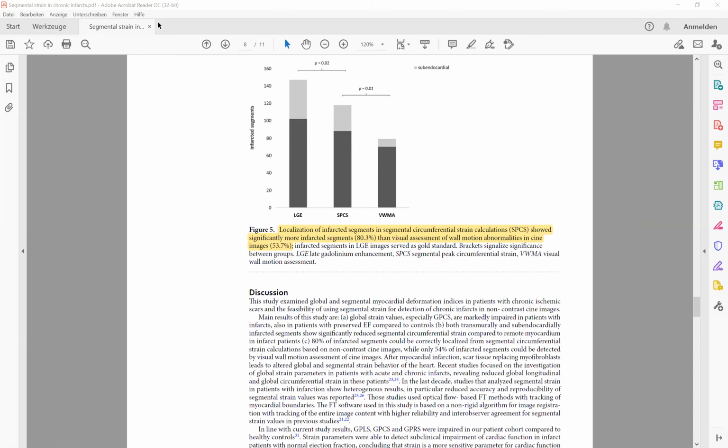Yes, of course. So first, I think we missed one patient with a subendocardial infarction. We saw it in LGE, obviously, but it was so low. It was nearly in the apex, and the apex cannot be detected. That's also one limitation. I forgot, I'm sorry. It's for the 16 segment model. So if you only have an infarction of the apex, it won't be detected. And the second question was, whenever we acquire the CINE sequence, it is always pre-contrast, always. So it was without contrast.